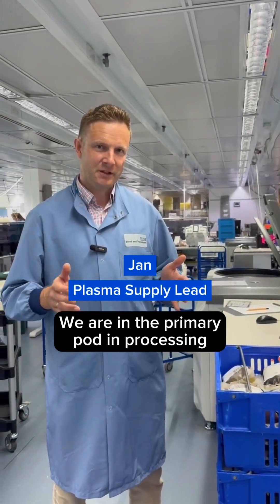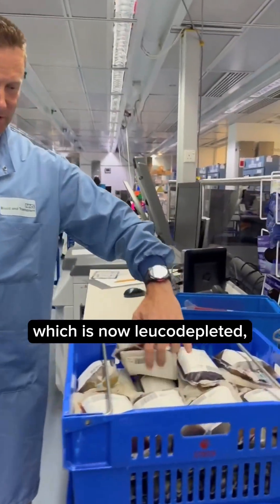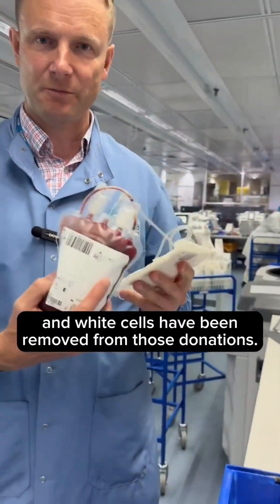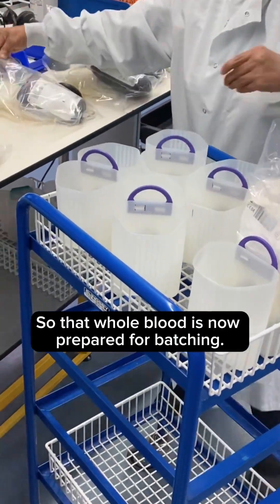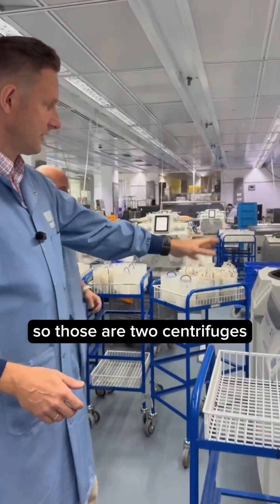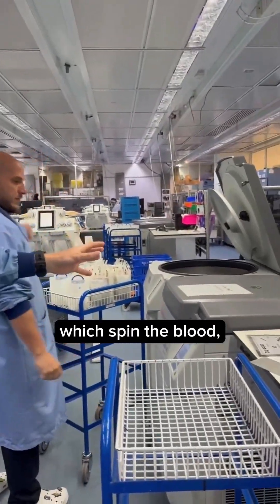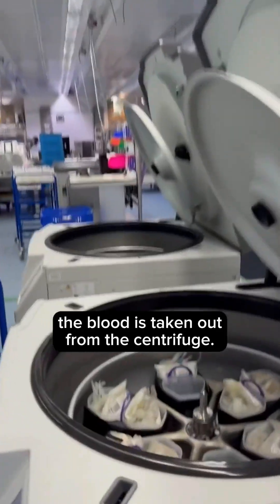We are in the primary processing area, starting with whole blood which is now leukodepleted — it has been filtered and white cells have been removed from this donation. That whole blood is now prepared for batching, then centrifugation takes place. Those are two centrifuges which spin the blood, and when the spinning is complete the blood is taken out from the centrifuge.